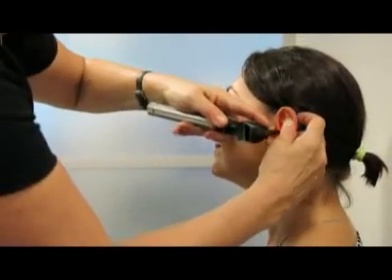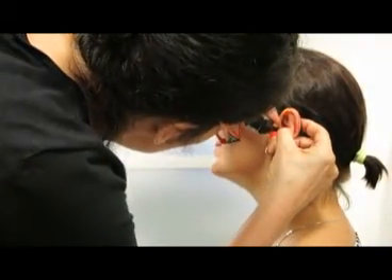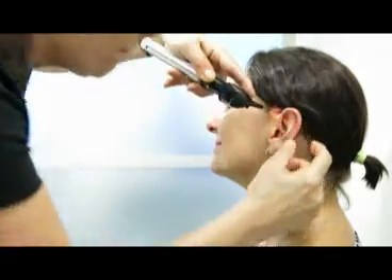And now I'm just going to have a look in her ear to make sure that I have no impression material left in her ear. I'll just press the trigger and pull it up.